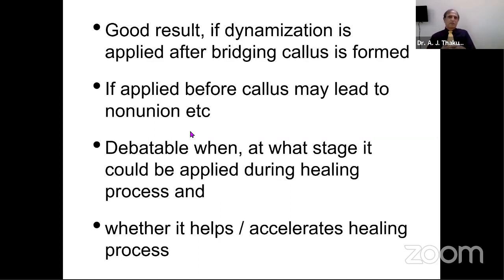If dynamization is applied after the bridging callus, once you see some kind of callus, you dynamize, then it will expedite the callus formation. But if it is dynamized, if this frame is weakened before you see any kind of callus formation, then non-union will occur. So before dynamizing, one must wait and watch that bridging callus is seen. Once the callus is seen, you can dynamize it. It will expedite the formation.